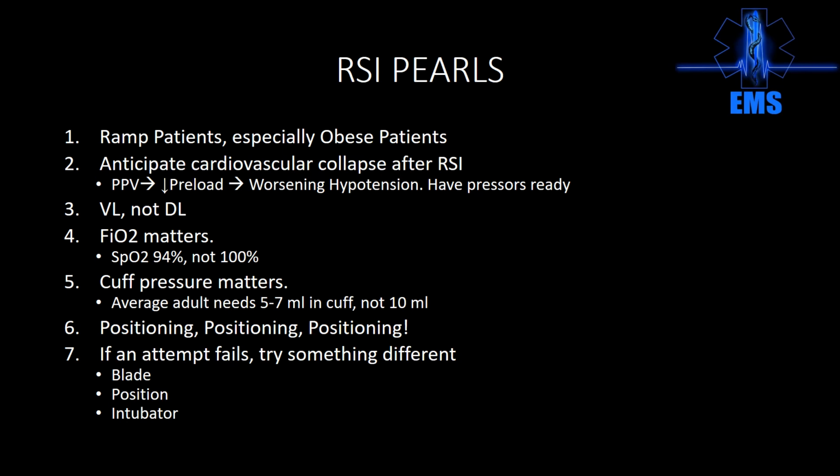I can't say it enough, folks. Positioning, positioning, positioning. If you walk away from nothing else from this topic or from this talk, remember external auditory canal, align with the sternal notch, ramp up obese patients, positioning. As long as you position the patient, your first pass success will be much higher. If an attempt fails, have somebody, not yourself, bag the patient, and then try something different.